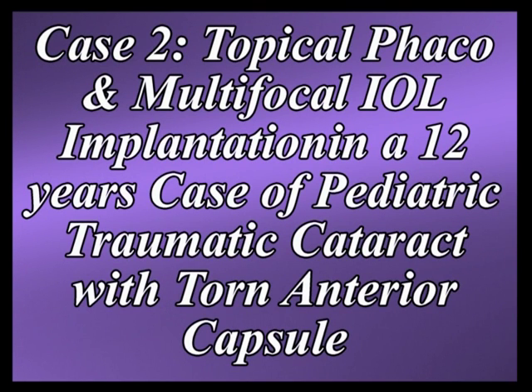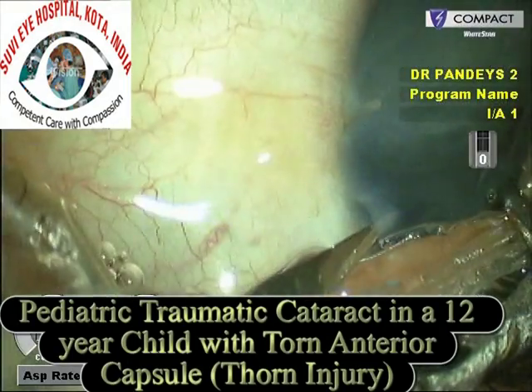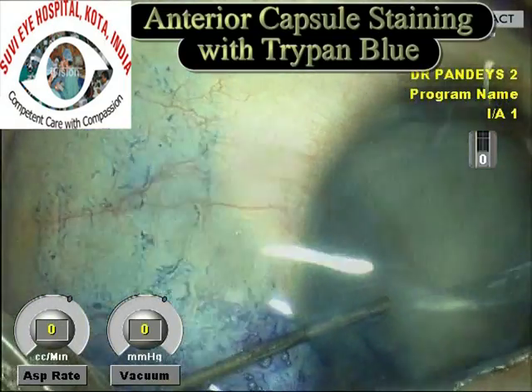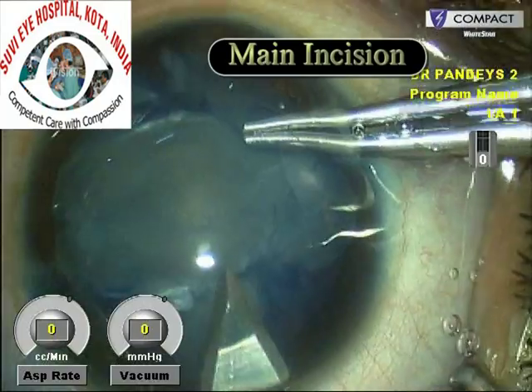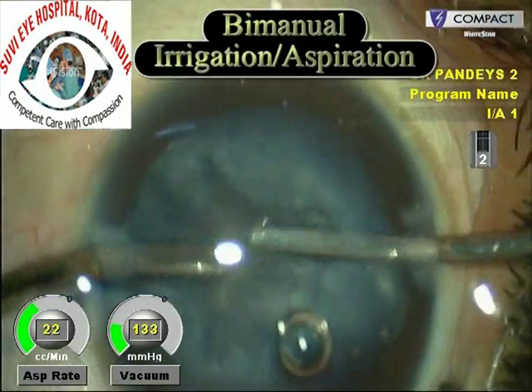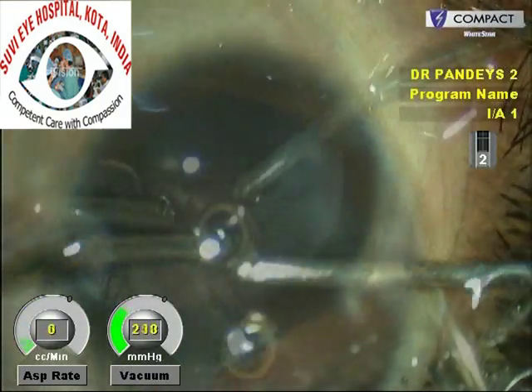The second case is a 12-year-old child with a traumatic cataract and torn anterior capsule, where lens aspiration with multifocal IOL implantation was done under topical anesthesia. The child presented with a cataract formed as a result of a thorn injury. The cataract was white in color, and when capsule dye staining was done, a horizontal split was seen exactly in the center. There was also some flocculent lens matter in the anterior chamber, and bimanual irrigation aspiration was sufficient to remove the soft lens matter.